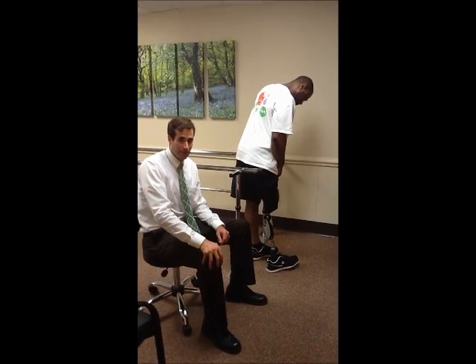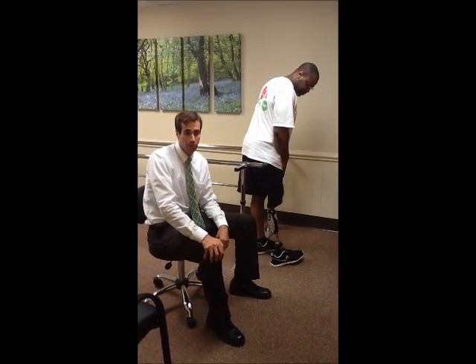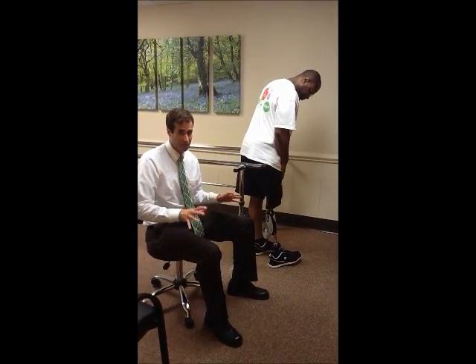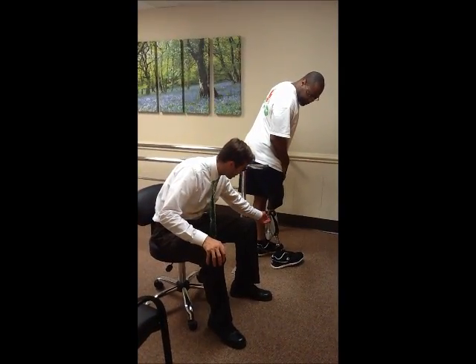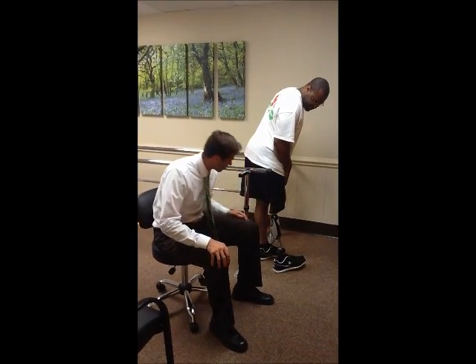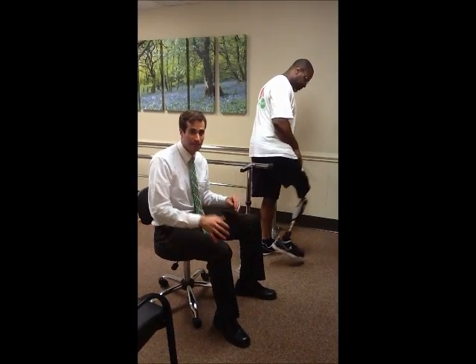Another feature of the Malk Knee is it has a free-wheeling mode, so to speak. This is often used when using a bike, so you can essentially disengage the hydraulic cylinder and let the knee be used while riding a bike. To do that, you weight the prosthetic foot — typically you'll weight the toe — and you flip this lever up. Now when you do that, you can see the knee is completely free and would allow you to easily ride a bike.